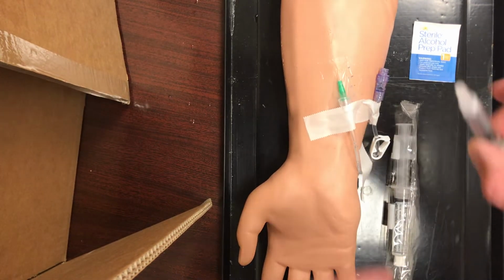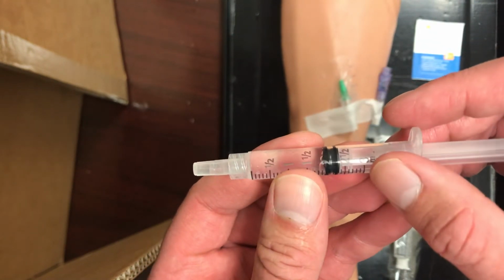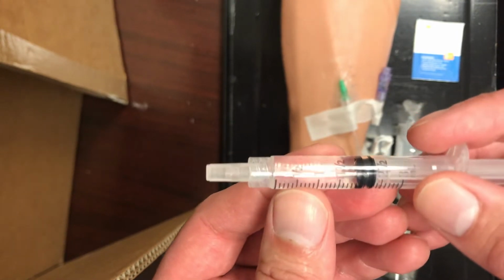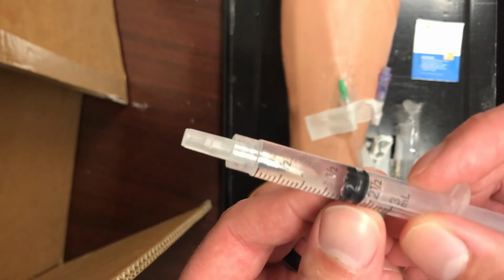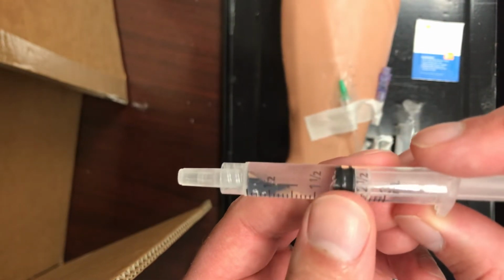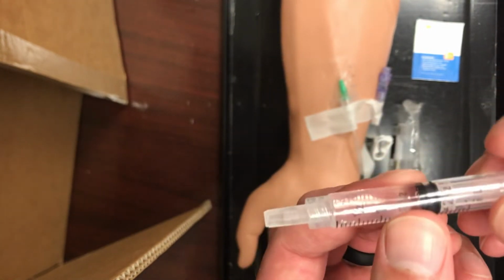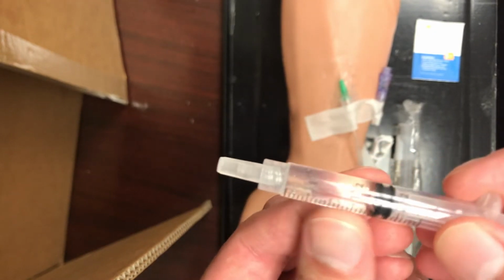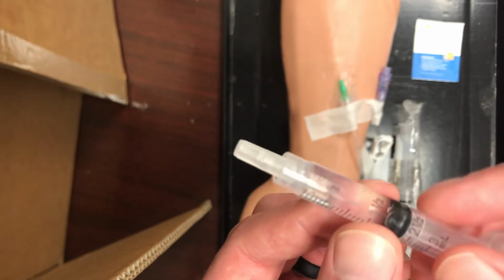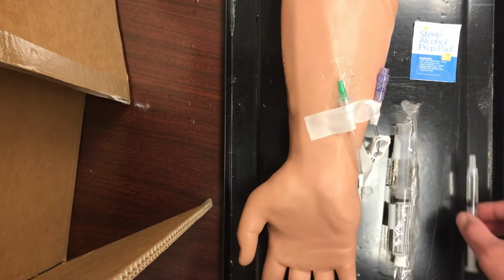Now for this, I have a 3 mL syringe, which brings me to my next topic. We want to make sure we have the appropriate size syringe for the amount of medication that we're giving. In this case, as an example, this is just filled with sodium chloride, I have it to 2 mLs, which is in a 3 mL syringe. This is appropriate for this amount of medication. If it's 5 mLs, typically we can use either a 5 mL syringe or a 10 mL syringe, and so forth. We just want to make sure we have enough space once we withdraw it out of the vial. So, once we've done that, we'll put that to the side.